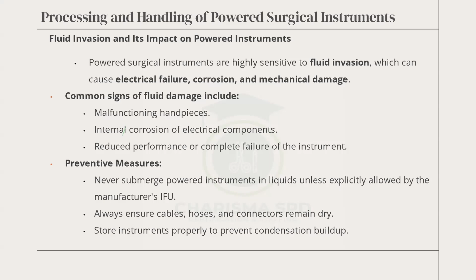How do we prevent that? How can we make sure that we don't allow water or fluid to enter into the powered surgical instrument? Never submerge. I don't even want to read the whole thing because I have mentioned it already. Always ensure cables, hoses, and connectors remain dry. Okay. Cables and hoses.